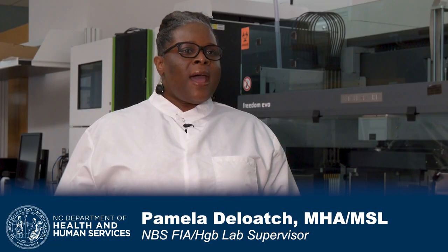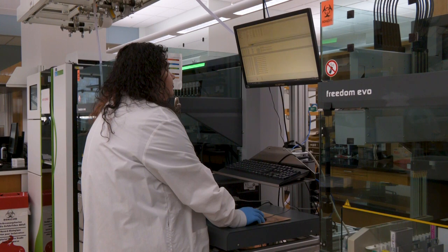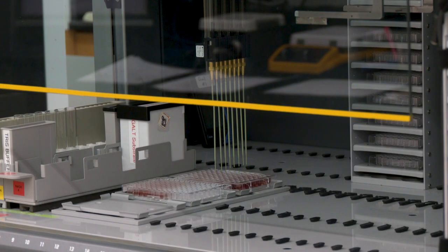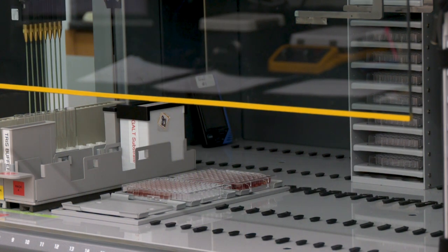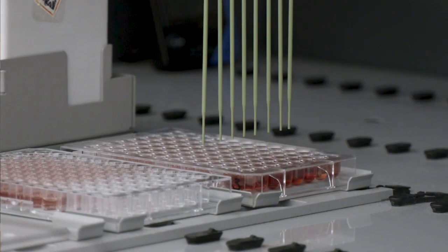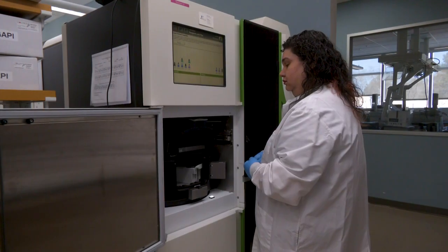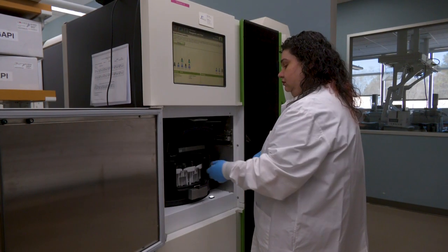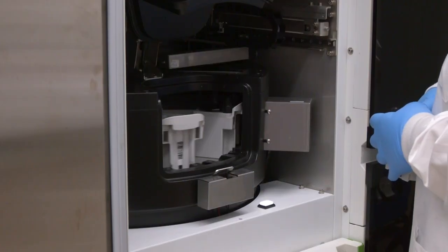The Fluoroimmunoassay, or FIA laboratory, screens newborn specimens for several endocrine and metabolic disorders. This lab tests the baby's dried blood spot using proteins that give off light. Our laboratory instruments can measure this light. FIA tests are used to check the levels of certain chemical messengers or hormones and special proteins in the baby that change food into energy. Examples of critical conditions identified utilizing fluoroimmunoassay technology are galactosemia and congenital adrenal hyperplasia.